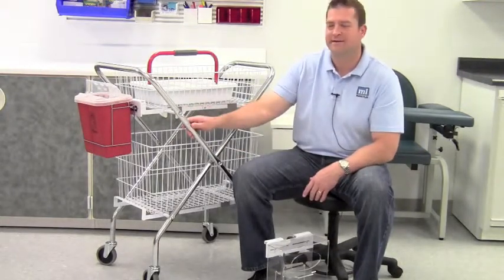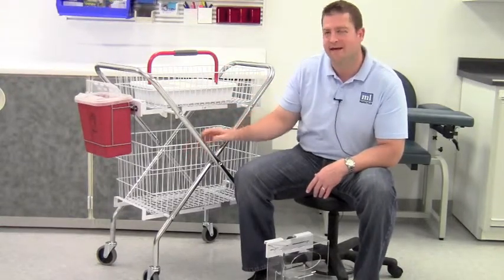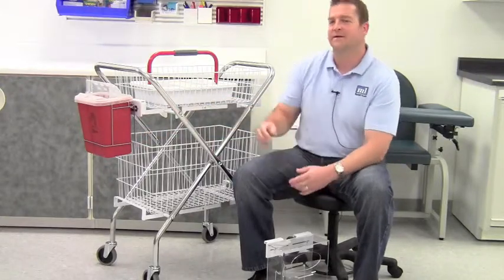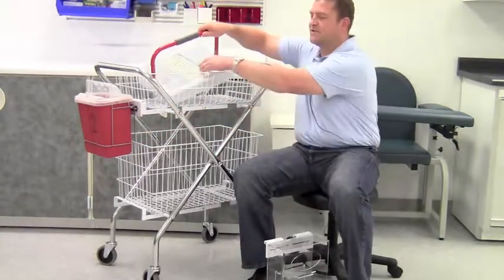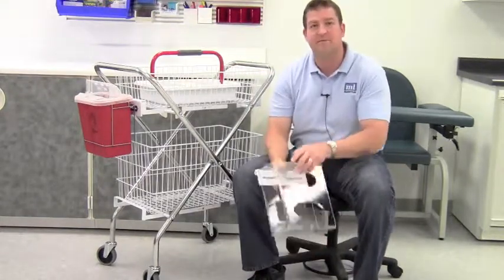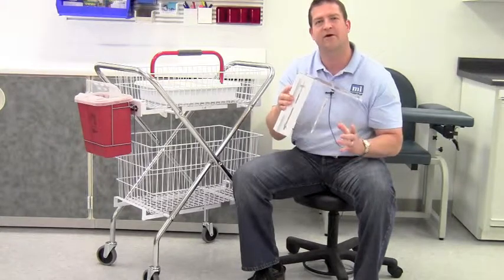This deluxe model includes the cart frame, a 6 inch basket, a 12 inch basket, and an 8 quart sharps container with a mounting bracket. It also includes a phlebotomy tray with a tube rack, a double side loading glove dispenser, and 2 wire cart holsters.